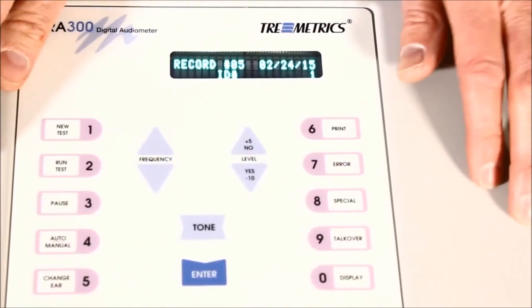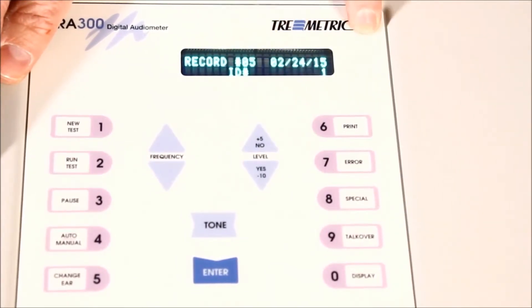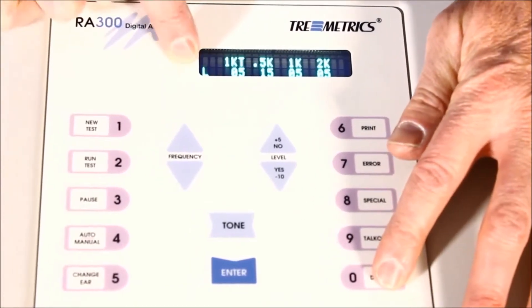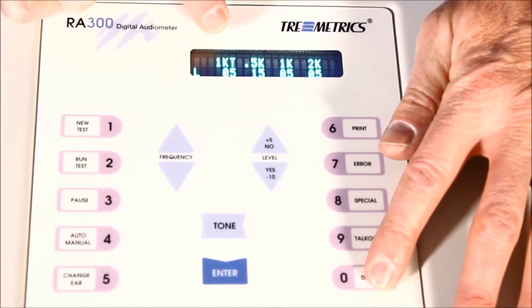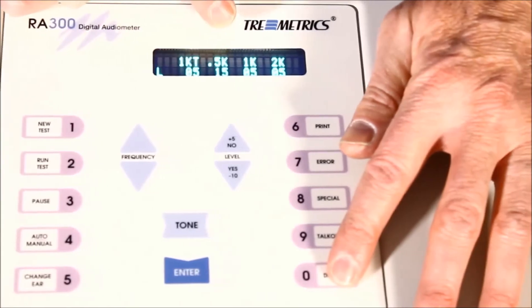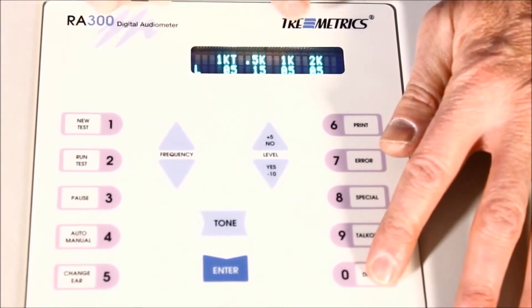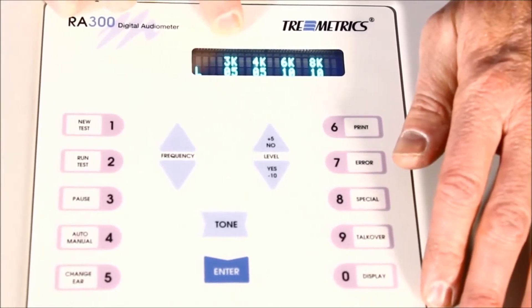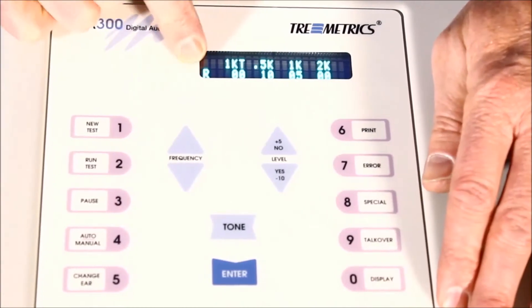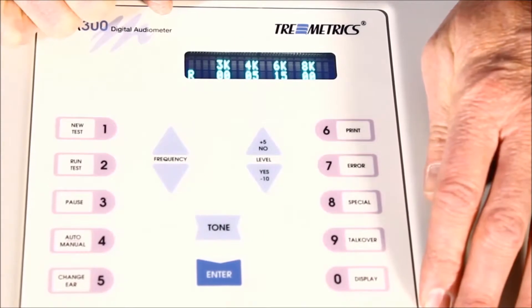Once the test is completed, we simply hit the display button, and it shows us the date of the test and the ID number of the person who's taken the test. By toggling the switch, we can see their results starting in the left ear — 500 Hz at 15 in this example, 1,000 Hz at 5. Hit the display key to see results through 8,000 Hz, hit display again to switch to the right ear, and toggle through to chart or copy the results.